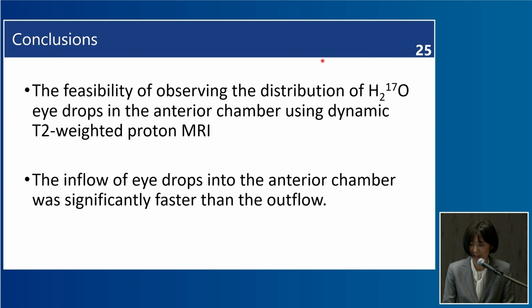In summary, our study demonstrated the feasibility of observing the distribution of O17 water eye drops in the anterior chamber using dynamic T2-weighted proton MRI. The inflow of eye drops into the anterior chamber was significantly faster than the outflow.